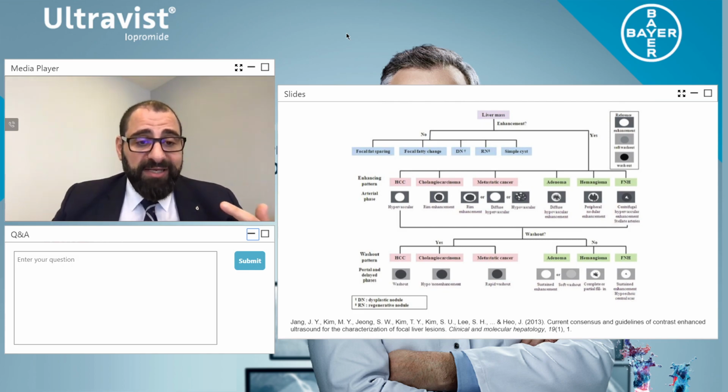Third, breath hold technique and imaging parameters. All of this allows you to put the picture together to get good optimal imaging techniques. And ladies and gentlemen, don't make big changes in your department straight away.